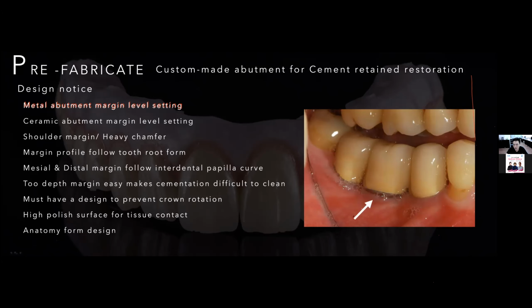So when we make the metal abutment, we must be very careful to set our margin and the form.